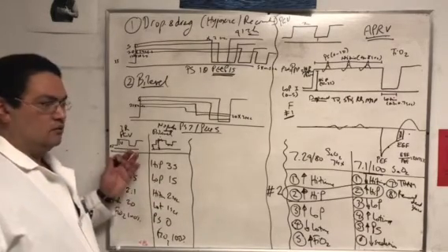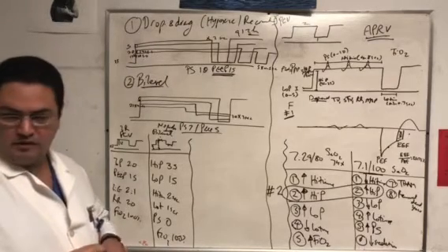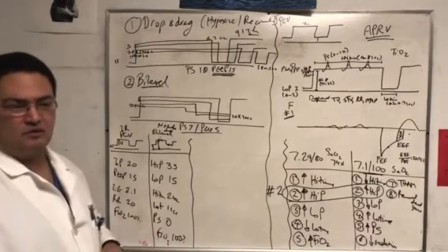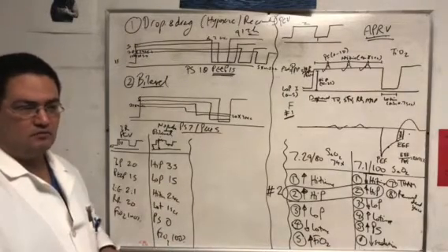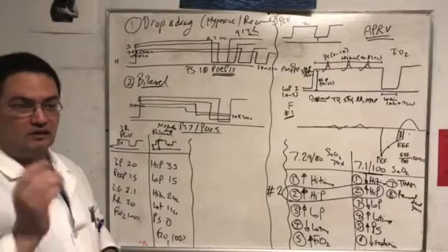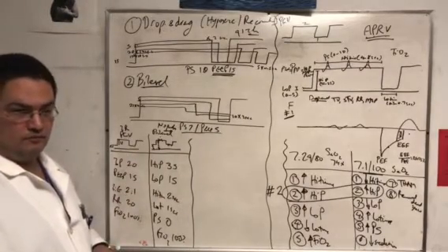But what if you already had paralyzed the patient during this hospitalization, and you already paralyzed the patient, you're gonna paralyze him again, he's gonna be weak. Or what if the patient has myasthenia gravis? What if the patient has, you know, some critical care myopathy or something? You don't want to paralyze him again. This will be a great mode for you, right?